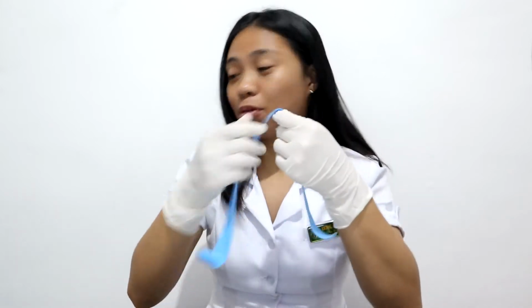We will be doing this twice. First is for locating the vein, and next is when we will be performing the venipuncture. So I will perform the tourniquet application on this bottle.